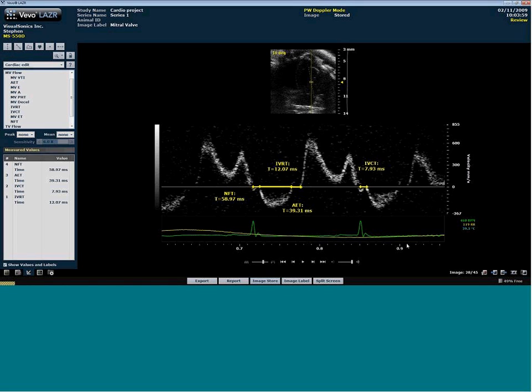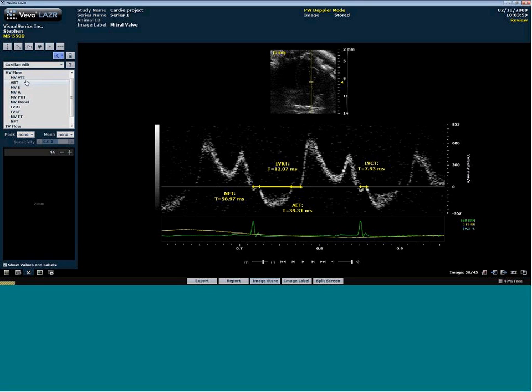Great. So even when you're placing those points, are you actually using that zoom window on the left side to really hone in on exactly where you want to start and end those points? Yeah, I am actually, and that's a good point. Whenever you select a measurement off of here, you get the zoom window that shows up here on the left side. So you can see in very closely how to place those measurements.